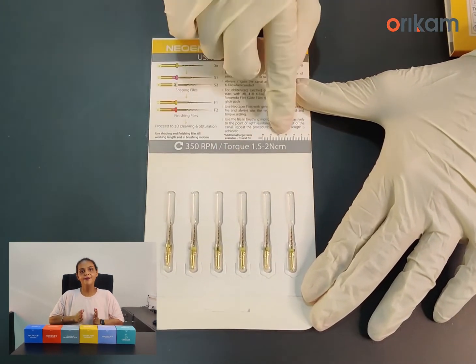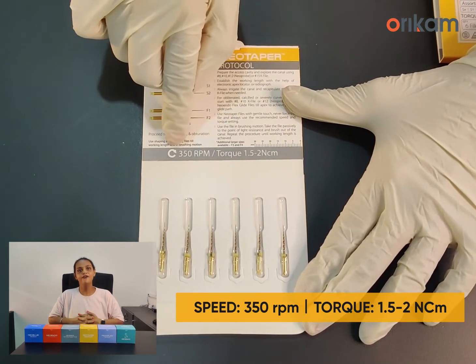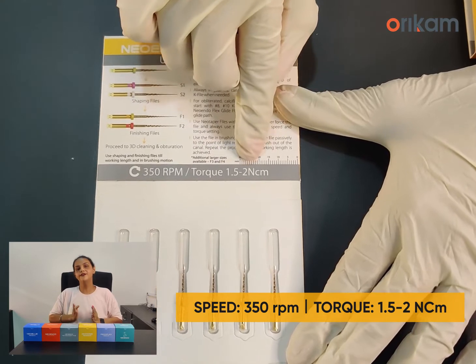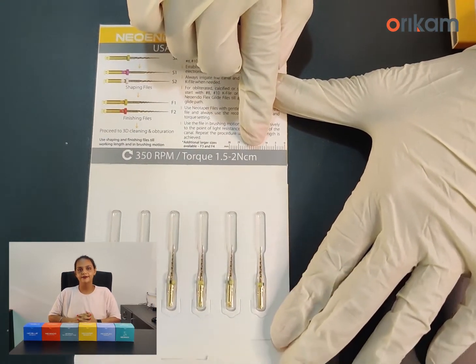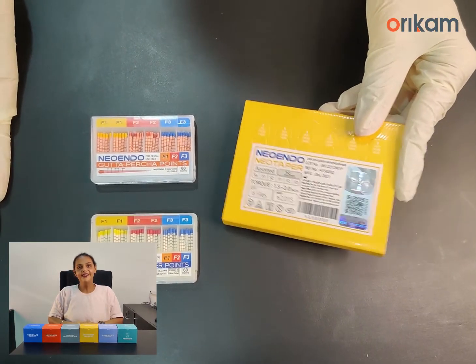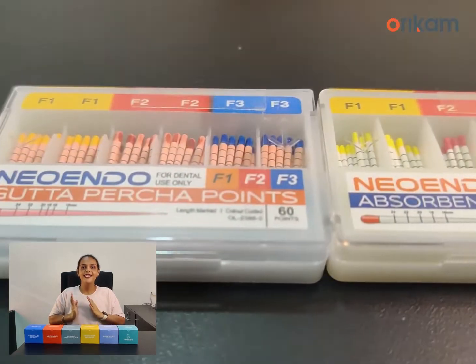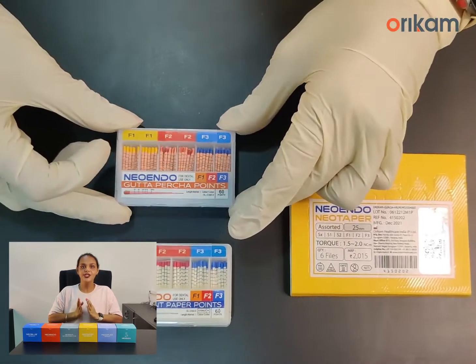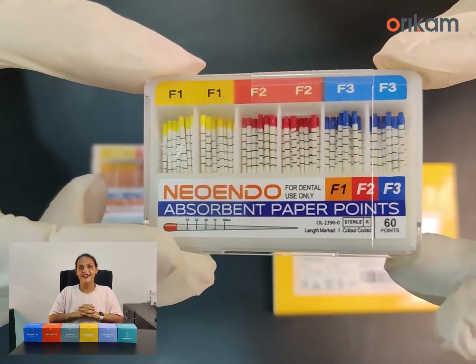The recommended speed and torque of the NeoTaper file system is 350 RPM and 1.5 to 2 Ncm torque. To complement the file system, we are also providing corresponding gutta-percha and absorbent paper points which will match the shape created by the NeoTaper files.